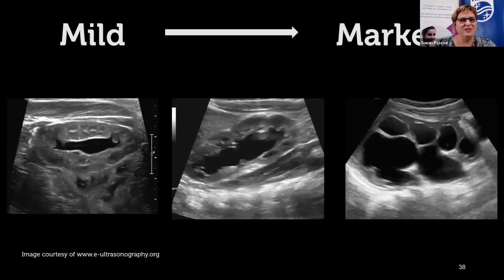So, if it's mild like that and they've gone to the toilet, that's not as much of a big concern, I think, as if you look and it's looking like this marked version or something more. See the separation here where there's no question when it's like this. This is like, oh, yeah, maybe not. You're wondering. I guess that's not as important. It's when we're starting to get to here or this clubbing where things are starting to get more worrisome. But you could practice on your early pregnant patients because their right kidney in particular is often mildly dilated, the left kidney not so much.